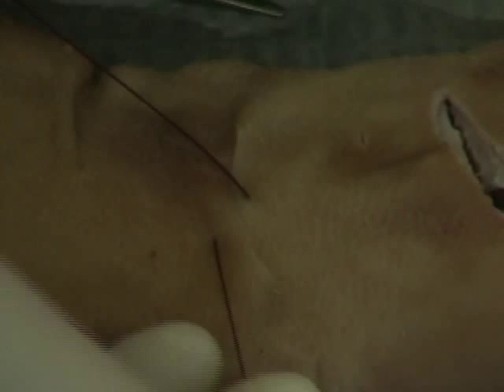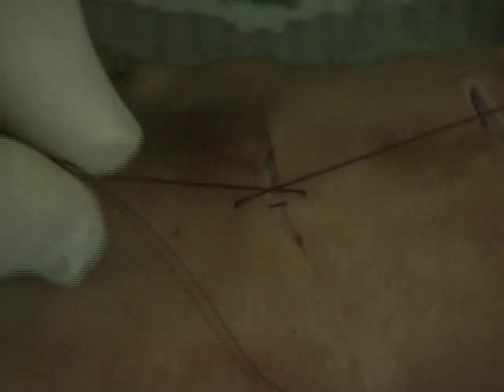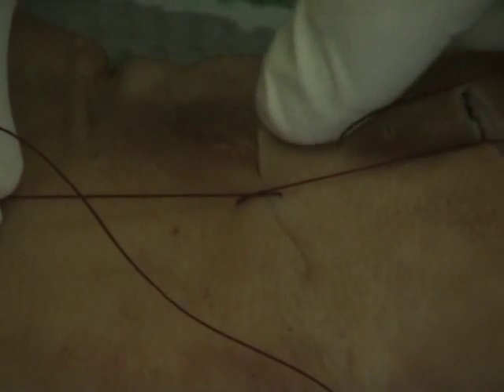Okay, if I pull a different direction, pull this direction, notice I can create dog ears. Or if I pull to this side over here, I can create dog ears. So I want to make sure that when I pull directly across, that I'm intending to minimize the dog ears. Okay, so this is certainly within the range of us being able to close this up. Notice when I do pull this closed, you notice there's a little bit on this side over here and a little bit here, but that's not enough for us to worry about.